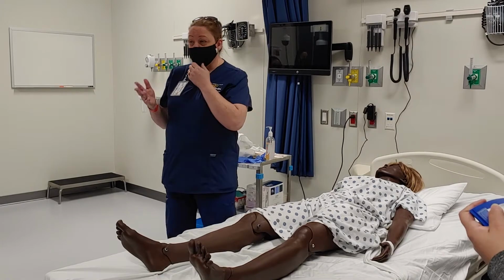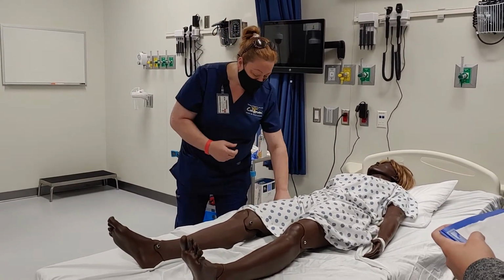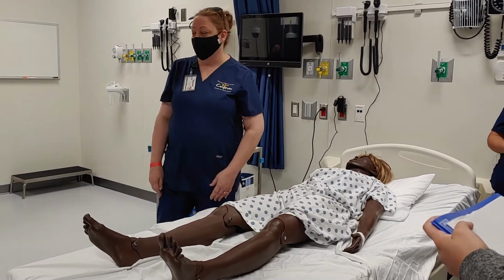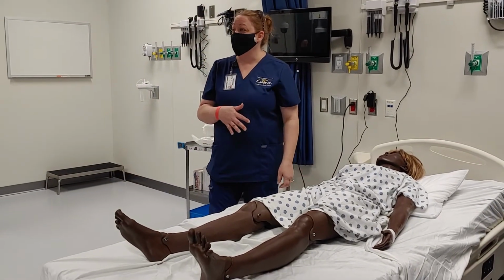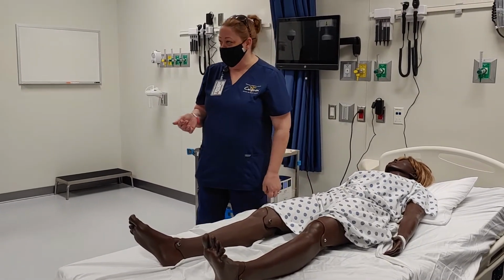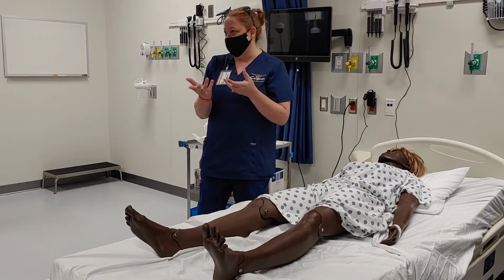So the first thing we're going to do when we come into the room, we're going to introduce ourselves, identify our patient. If they're an inpatient, we can check this as well, their name tag over here. But once we've done that, then we need to ask them if they were told that they were going to be catheterized, right? Make sure they understand what that is, okay? It's simply just inserting a tube into the bladder and draining the bladder.